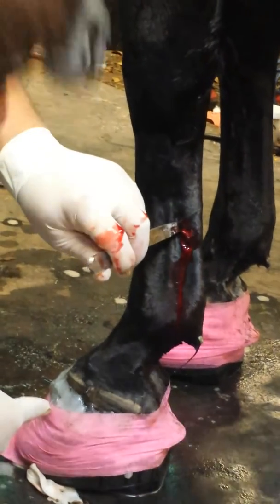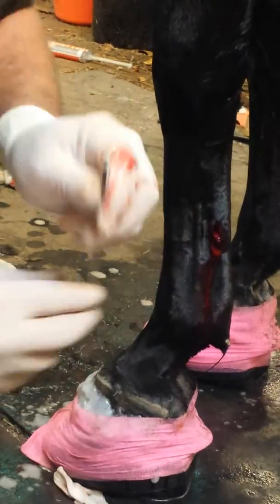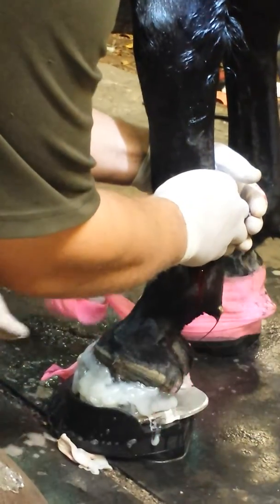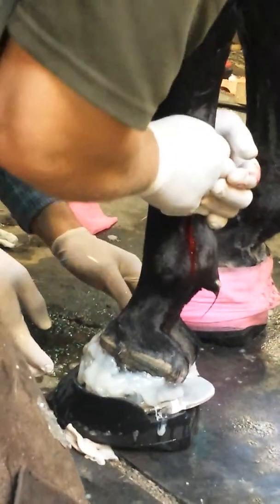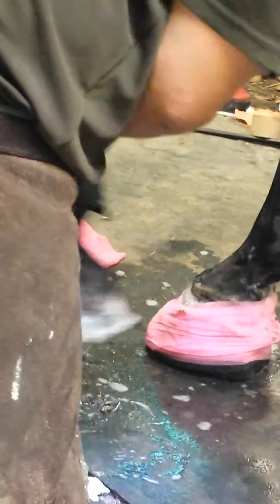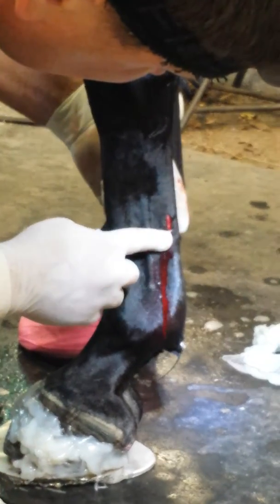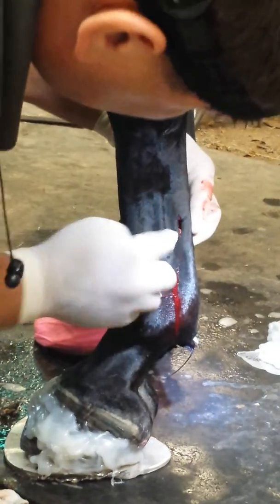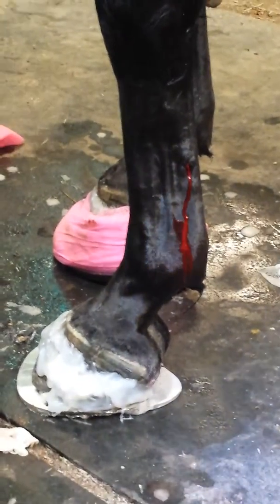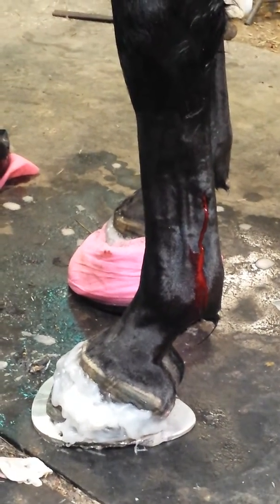Now Kyle, what I need you to do is pull that vet wrap off — you come around the front. Pull the vet wrap off, and I'm going to try to touch you in each stairwell here. I'm going to pull this off. We can set him down and we can see our tendon gap. There's the bottom of the tendon down here, and the top is way up here. So now we've got a nice tendon gap. We can inspect it for any potential fibers that we may have left, and it all looks nice and clean. Then usually just a horizontal mattress suture or two to close, and we're done.